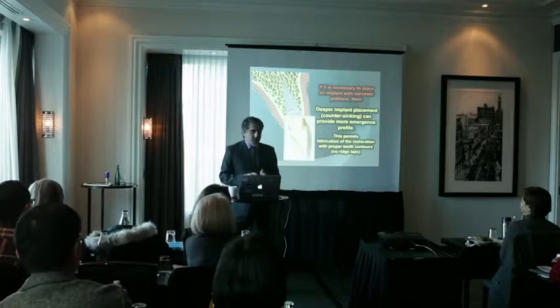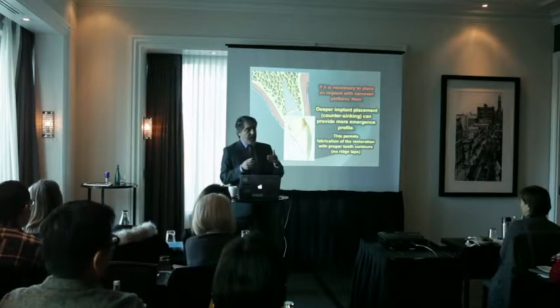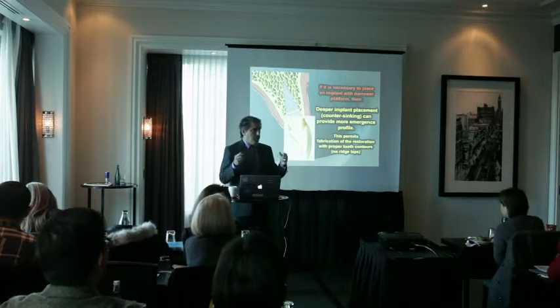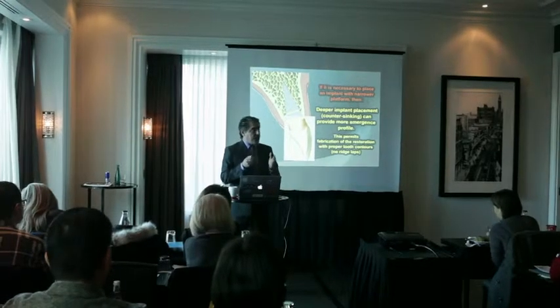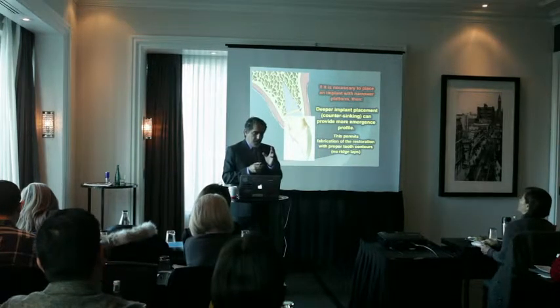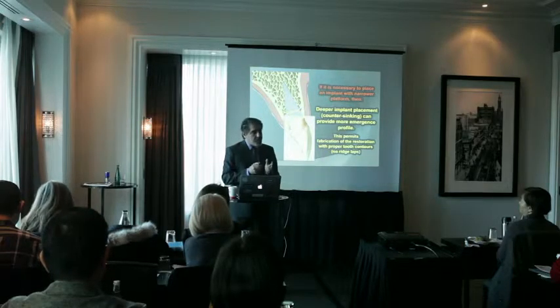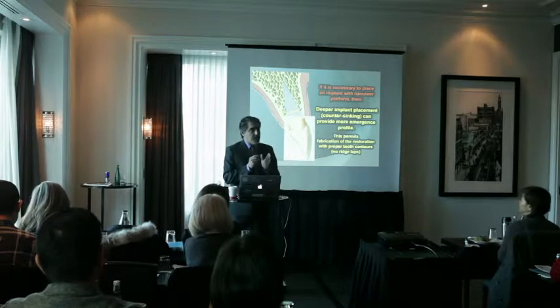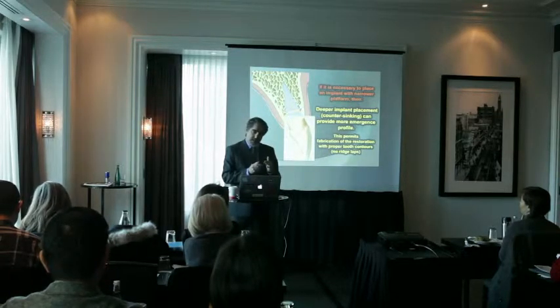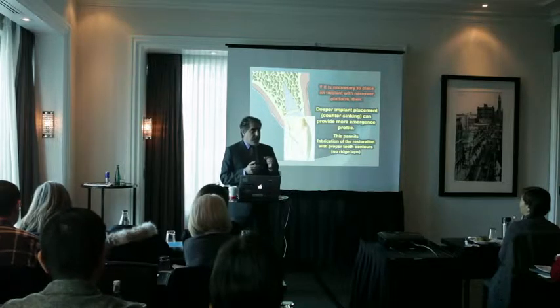If the surgeon is going to place the implant at the level of the bone, very shallow, then the implant has to be wide body. If I want to go a little bit forward and talk about the angulation, don't forget that when you look at the angulation of an implant placed superficially, at the level of the crest, it can affect our emergence profile.